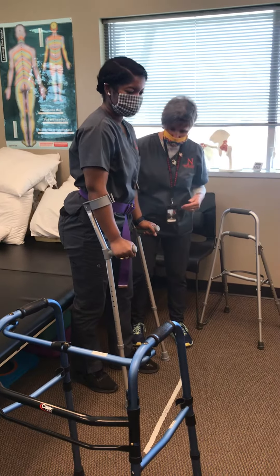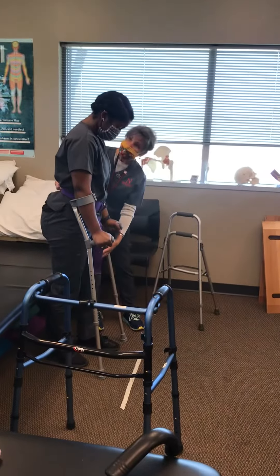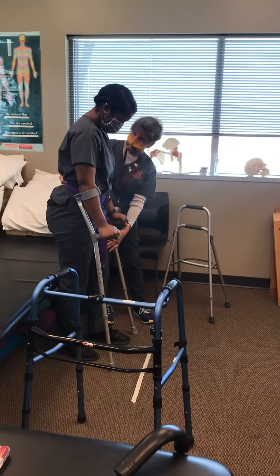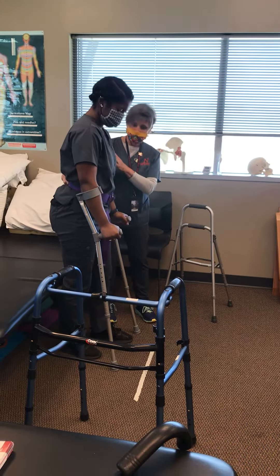So we're going to head off that way. However you feel comfortable, you can move this device and this leg together, or you can move this device and then the leg and then this device and the opposite leg — whatever you feel comfortable with.